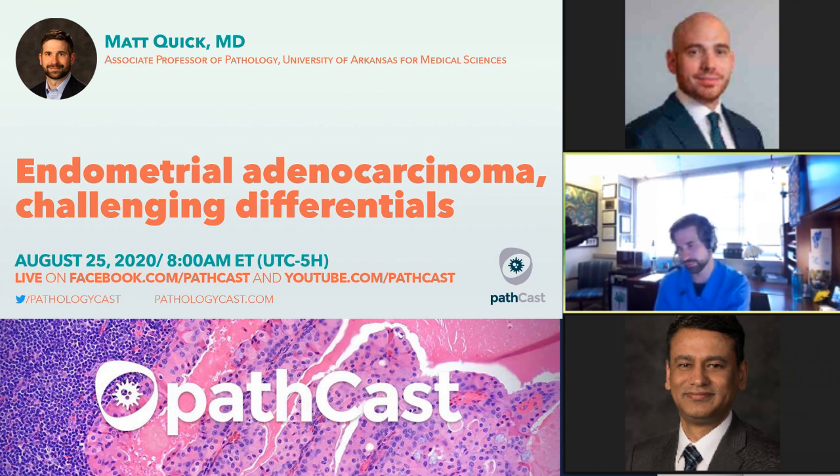Some people might say, well, what about Vimentin? I know this is one of the very few times you can actually use Vimentin and it be useful, other than being a positive control. So yeah, you can use Vimentin, although Vimentin staining in endometrium can be patchy, and you can see focal positivity in cervical lesions. So just know that Vimentin might be focally lying to you when you look at it. So be careful there.